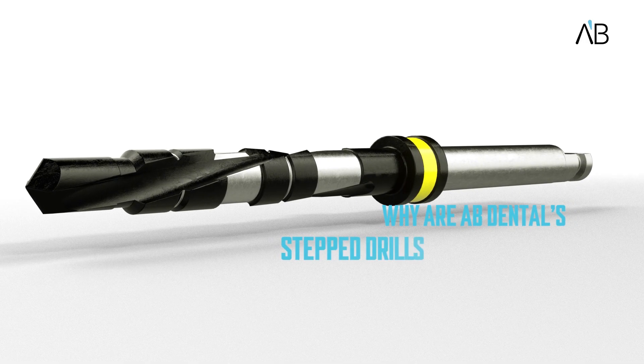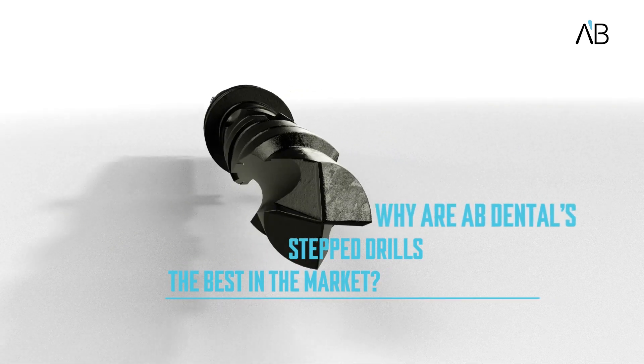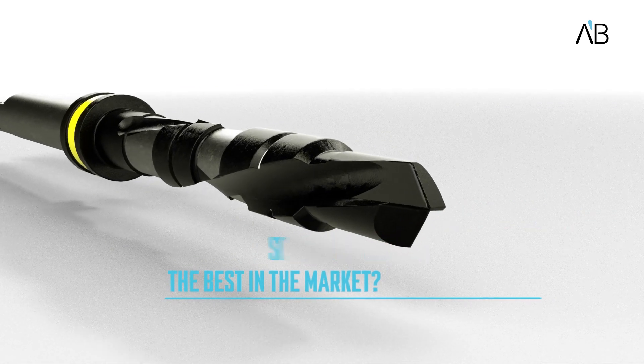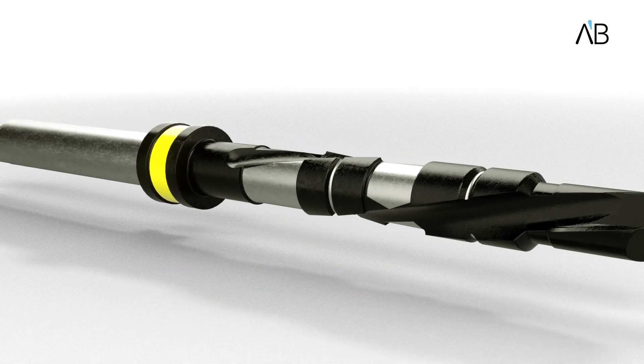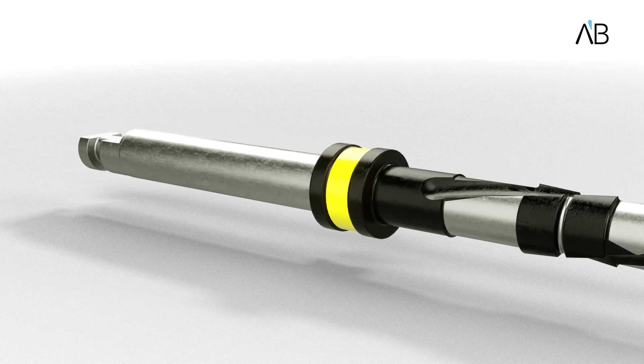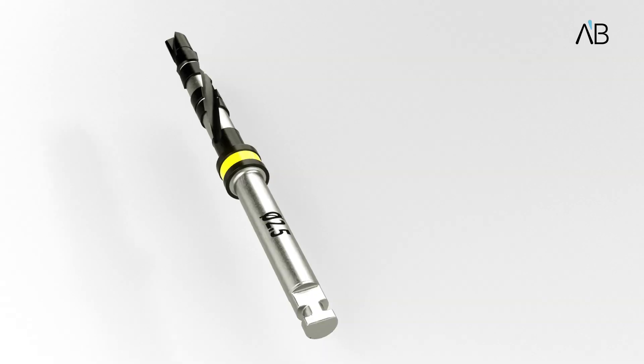Why are AB Dental step drills the best in the market? The apical four millimeters portion of the drill has the same diameter as the previous size drill. This enables high stability while drilling and provides better comfort and ease to the dentist to drill in a straight line.